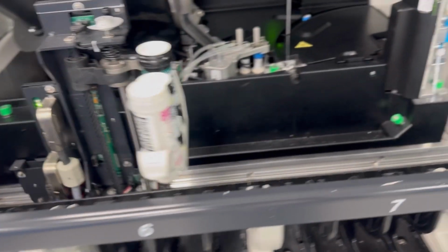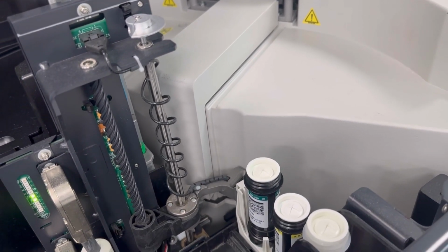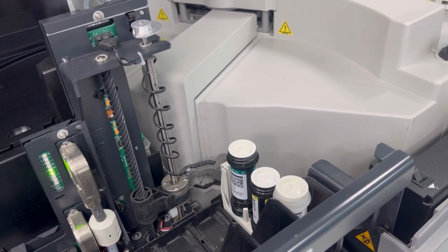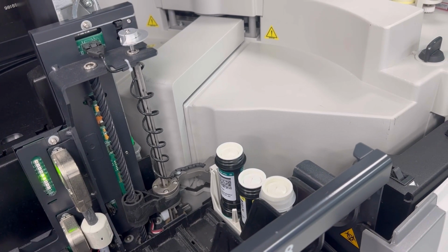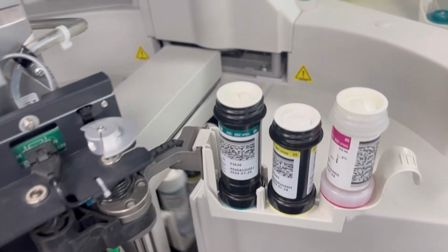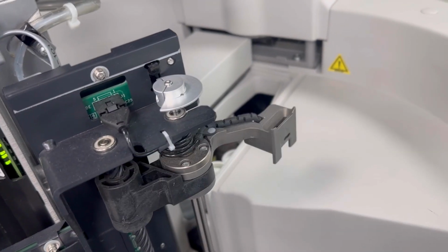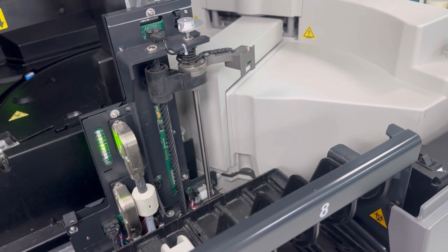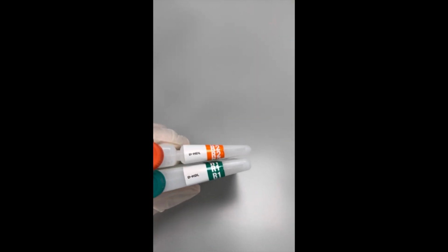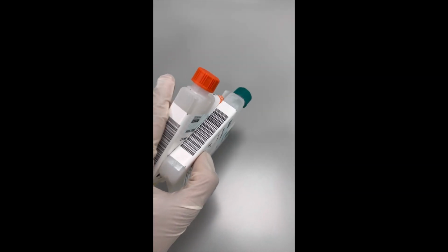As you can see here, the hormone reagents are getting scanned by the scanner in the machine. This is the sample holder. Now you can see the reagent for the hormones goes inside. It takes about 2 to 3 seconds to open the hormone reagent section. Here we have loaded all the reagents inside, so the reagent will enter here in this form. Then the holder comes back to its normal position.